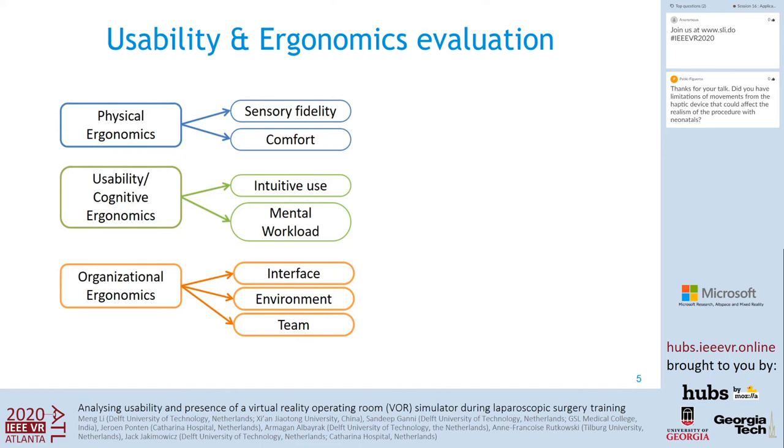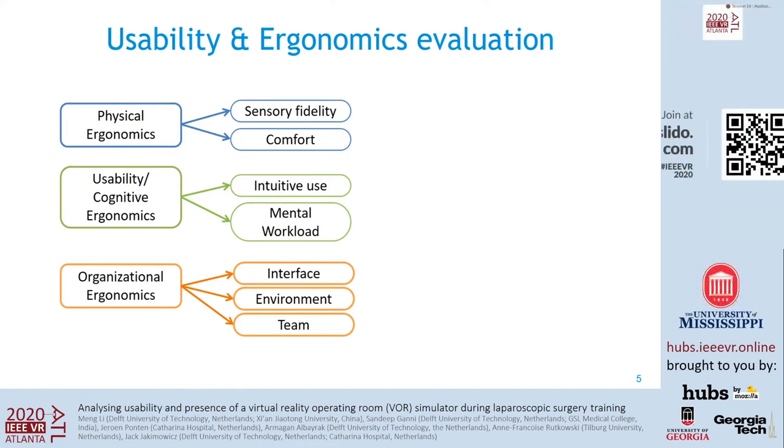Studies have reviewed the face validity and users' preference of immersive VR laparoscopic simulators, but how intuitively and proficiently users can utilize a virtual OR simulator to achieve their objectives is still unknown. Therefore, the focus of this study is to investigate usability and presence to identify the potential benefits and improvement opportunities of the virtual operating room.